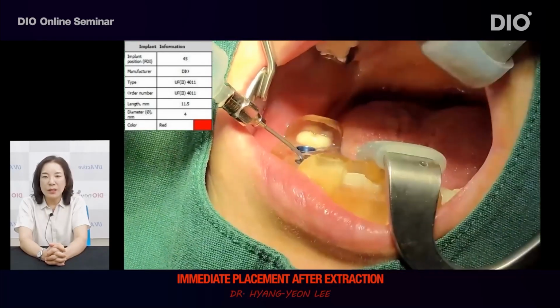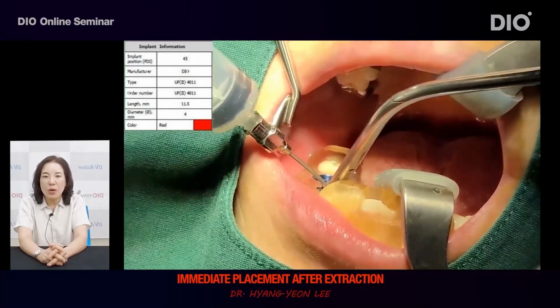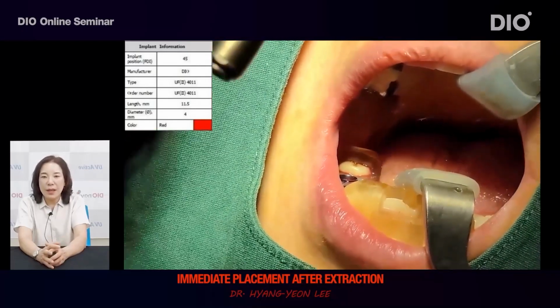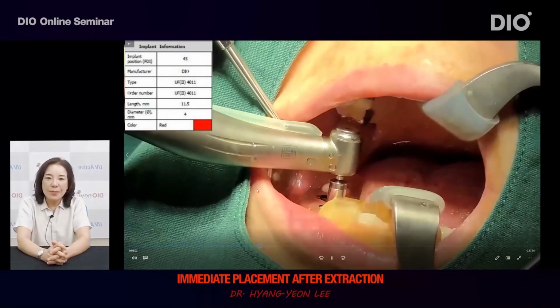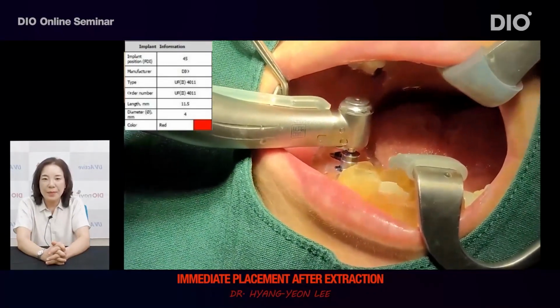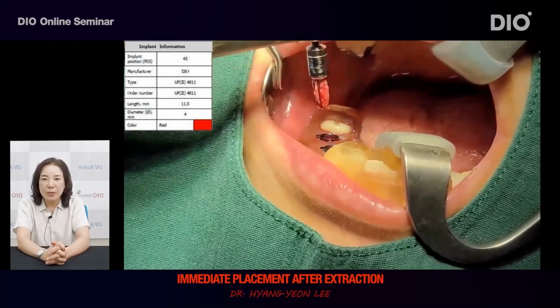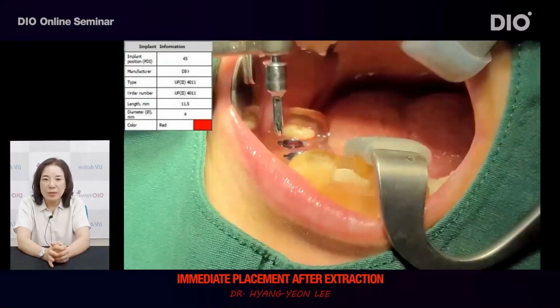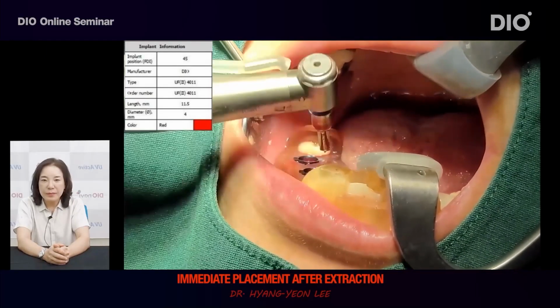Irrigate the drilled socket sufficiently to wash out the bone chips in the drill socket. Irrigation has dual functions of washing out the bone chips and cooling the area inside the socket to prevent bone heating. Execute profile drill at the speed of 100 RPM. More bone will be drilled out if profile drill is performed. Gather this and use it at the time of bone transplant.